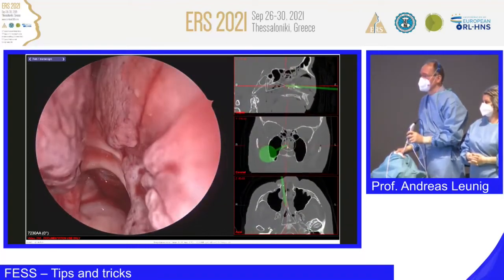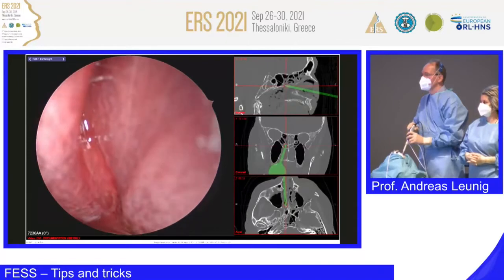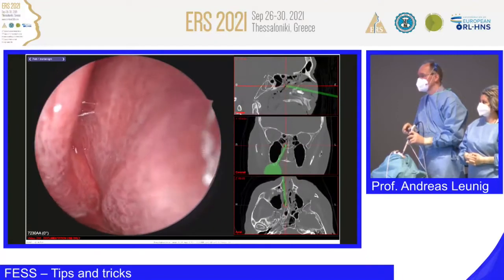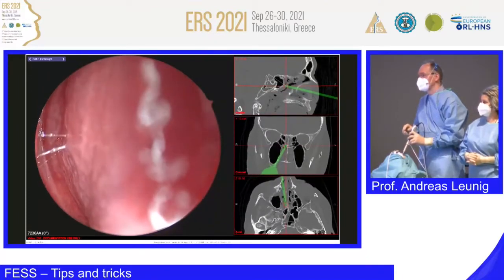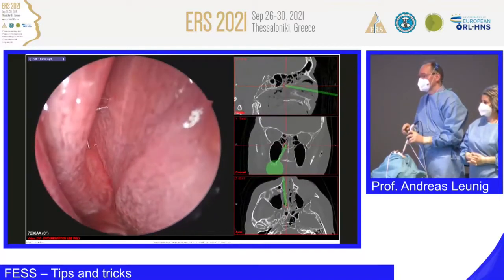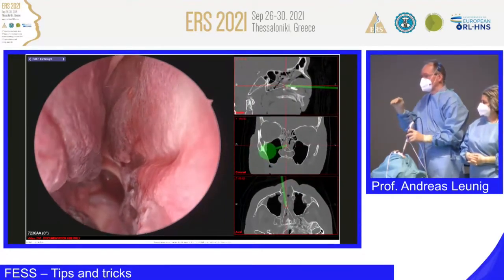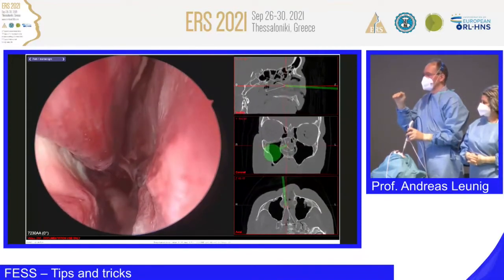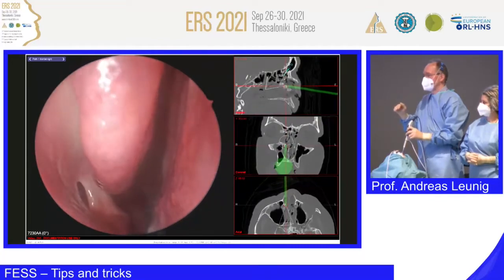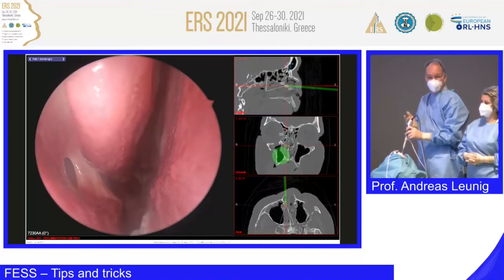We are going in between the middle turbinate and the septum, in the so-called sphenoethmoidal recess, and usually you would see, or you could in some cases see, the natural ostium of the sphenoid sinus. It must be here in the depth, just the cleft, the very narrow cleft there. There should be the natural ostium, and we are coming back a little bit more. And now we are going under the inferior part of the middle turbinate. And we are looking now into the middle meatus, and what you can see here is an opening. What do you think what this is? Is it the natural ostium of the maxillary sinus?